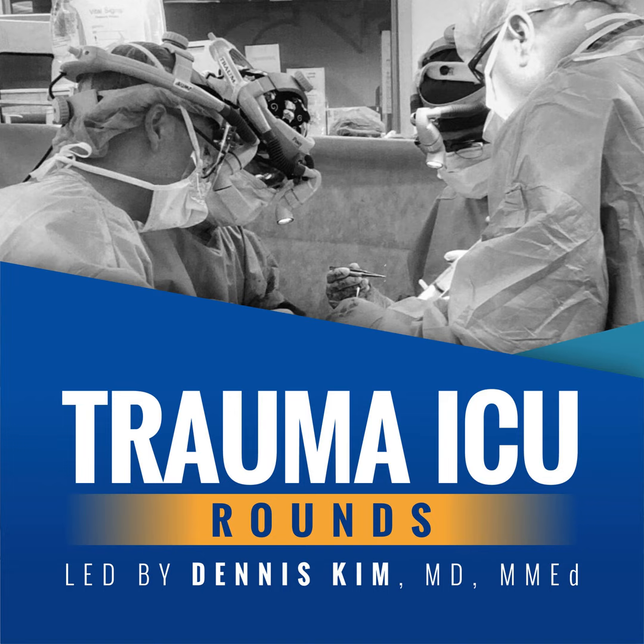As we move on to our second objective, the differences between volume and pressure targeted ventilation, I want to clarify a few things up front. Many people define the mode of ventilation based on whether the primary independent variable being manipulated is volume or pressure, whereas others have defined the mode based on the variable that determines when a breath cycles into expiration. Although I don't completely disagree with these approaches, I think the weakness is that they fail to capture what truly defines a mode, specifically the type of breath, as we just discussed, mandatory, spontaneous, or assisted, and the timing of breath delivery, which we'll discuss in just a few moments.